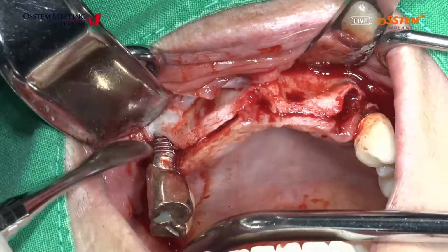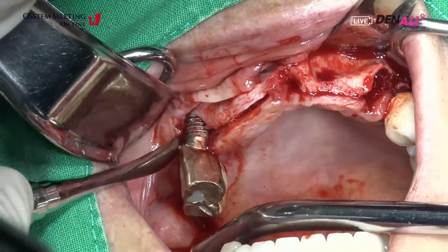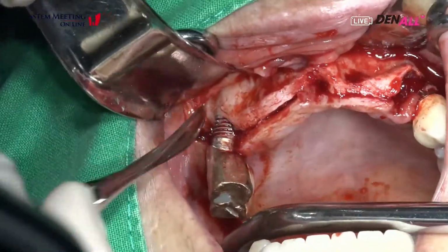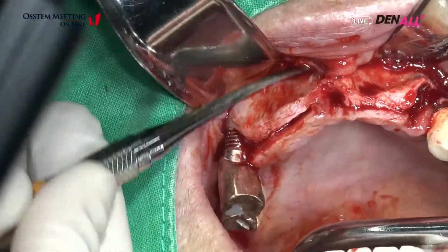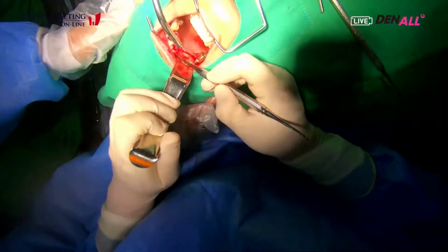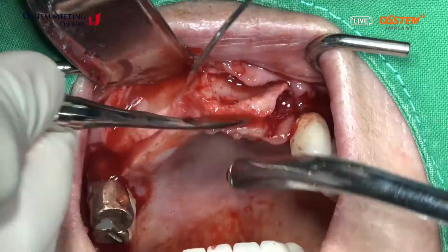As I mentioned, this right molar implant has severe peri-implantitis, but I will maintain it. After delivering the anterior prosthesis, I will treat this implant. Okay, flap elevation was done.